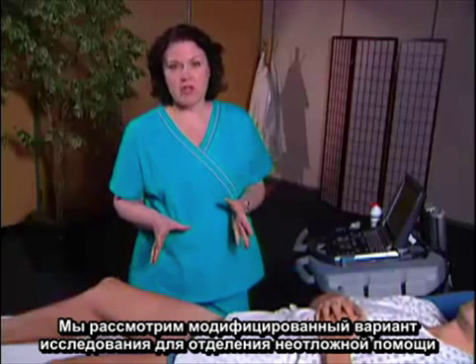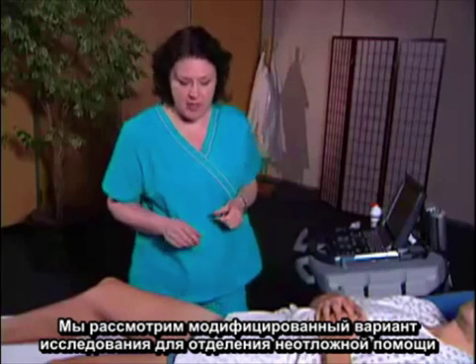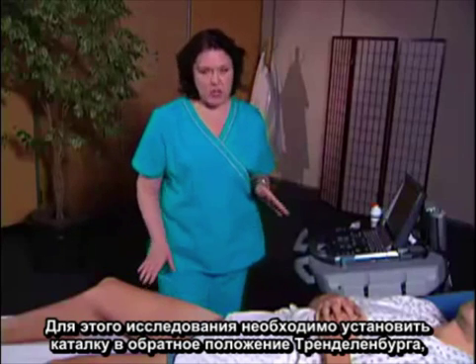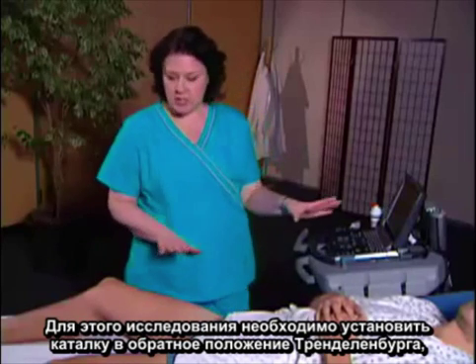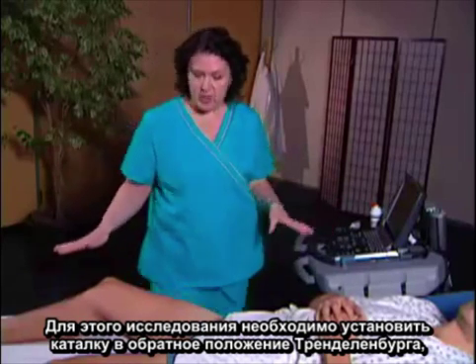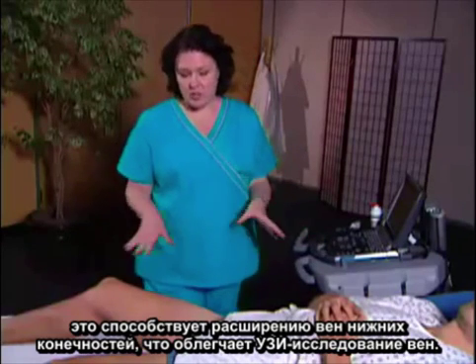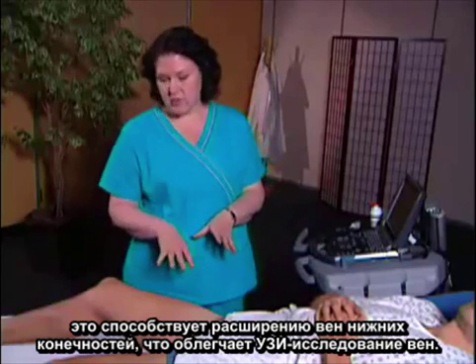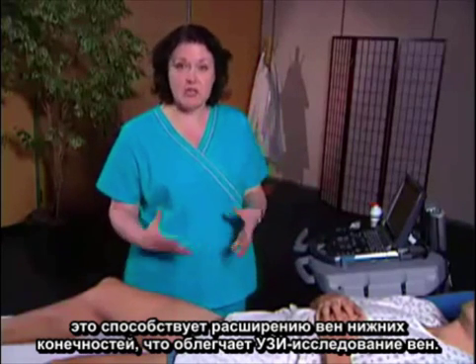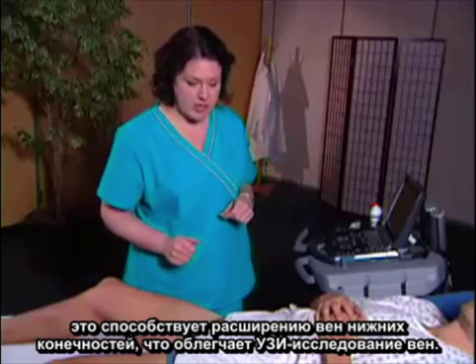We're going to do a modified version of that for the ED exam. To set up for this examination, you want to tilt the gurney so that you're in a reverse Trendelenburg, which encourages venous distension in the leg, making it easier to visualize the veins with ultrasound.